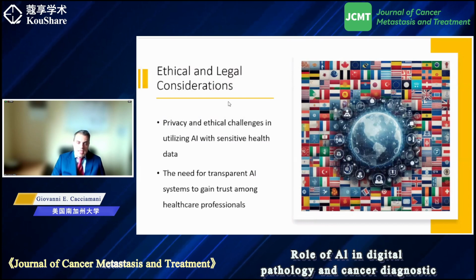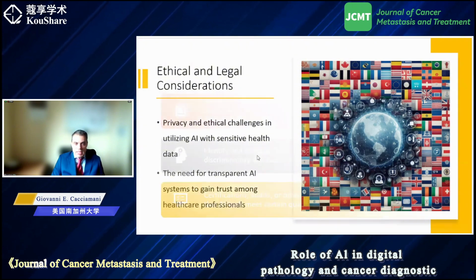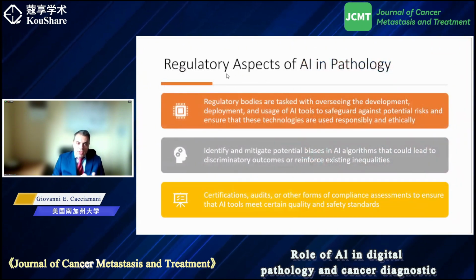So when we digitalize images, we need to associate them, of course, with data, because this is what artificial intelligence will integrate. So we need to be very careful when sensitive health data are put on a website, on a web database. And so we need to be transparent with the system, and we have to build quite a robust network in this regard.